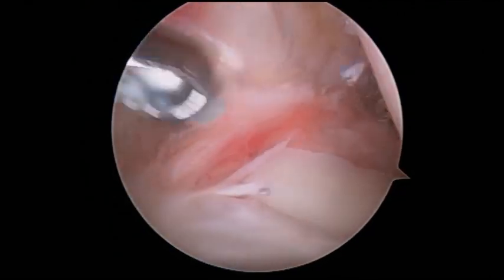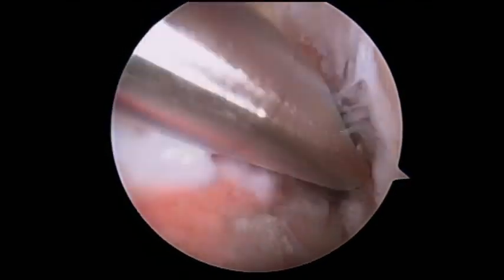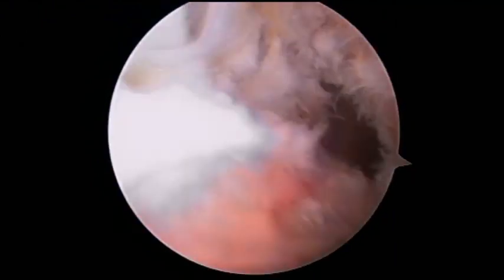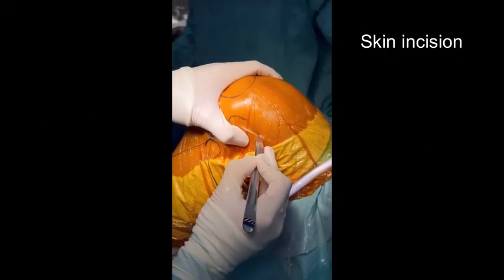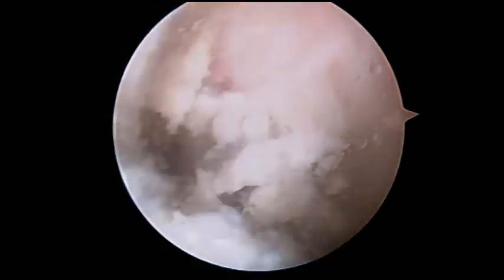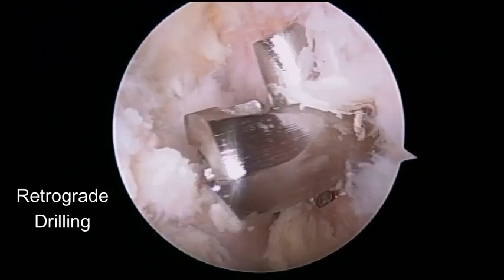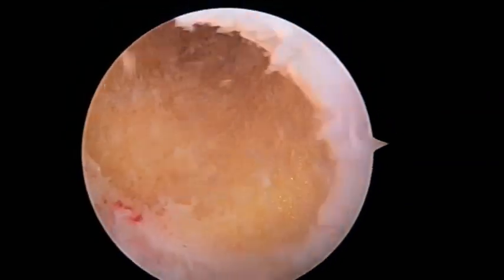Standard diagnostic arthroscopy is performed, and meniscus and cartilage injuries are treated accordingly. The tibial and femoral footprints of the ACL are identified. The incision is made slightly posterior and proximal to the lateral epicondyle, and the femoral ACL tunnel is created through an outside-in approach. A guide wire is inserted from the lateral femoral cortex at the appropriate point marked for optimal ALL function to the ACL femoral footprint, and the tunnel is created retrogradely.